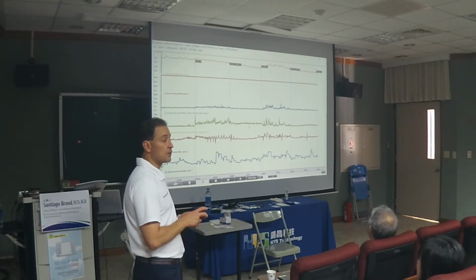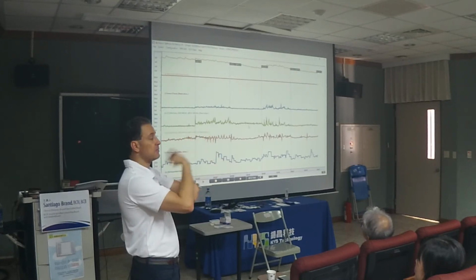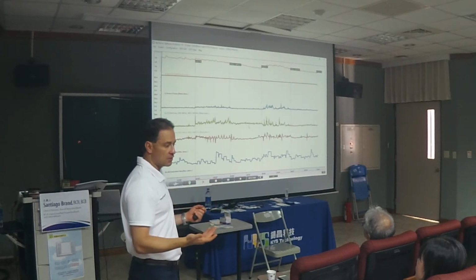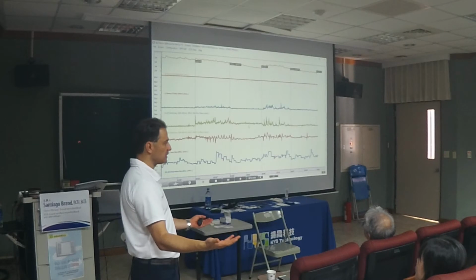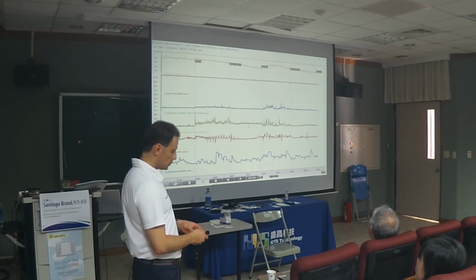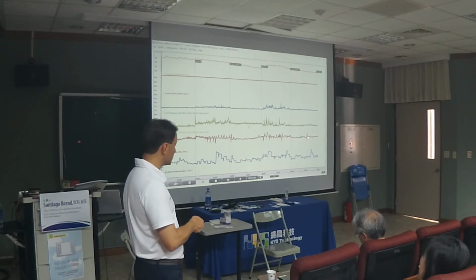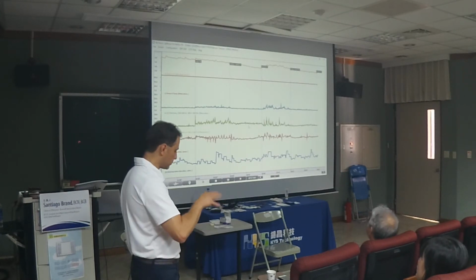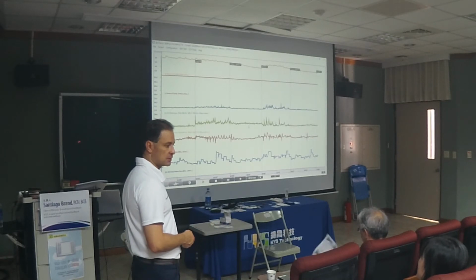Right. Now, the other thing you can do is remember you can tape the sensors so you minimize movement of the cable. And he was sitting on a chair that is not too comfortable. If you have the reclining chair, you're gonna have the arms to the sides, so you minimize those things. But it's a good question because you want to take all those things into account, because if you're doing research, that is going to be important. For this demo, and if you were my client, I wouldn't worry too much about it in the clinical setting, but in the lab, yes, that's something you might want to consider.